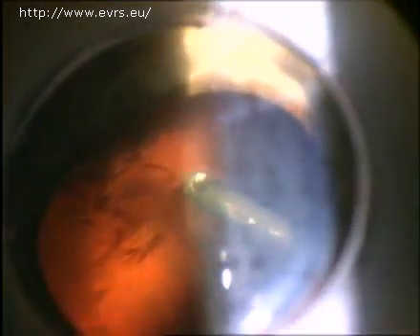One realizes that it is necessary to have the aspiration flow varied according to the particular conditions. But as we have already seen, the aspiration flow will depend upon a number of parameters that must be precisely controlled during the procedure if we hope to achieve a successful vitrectomy. This is what we are going to see here step by step.